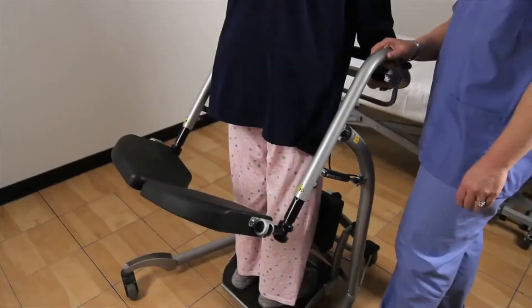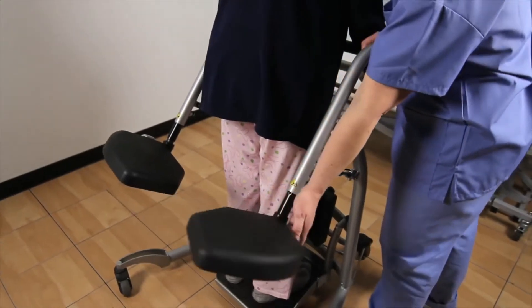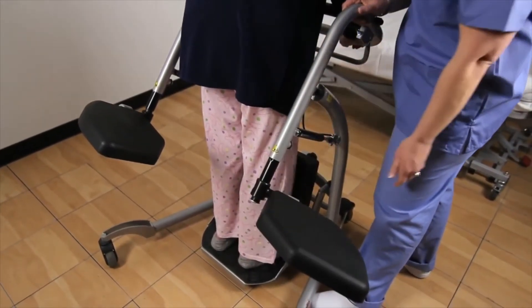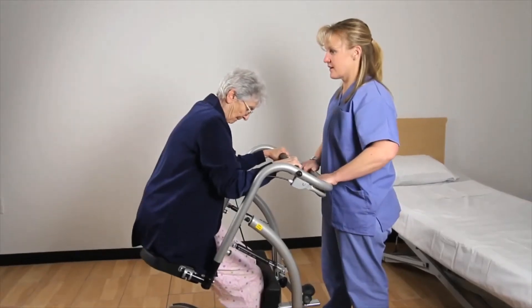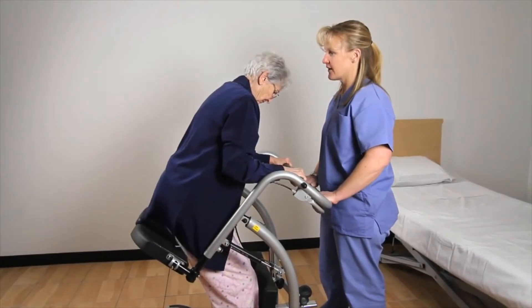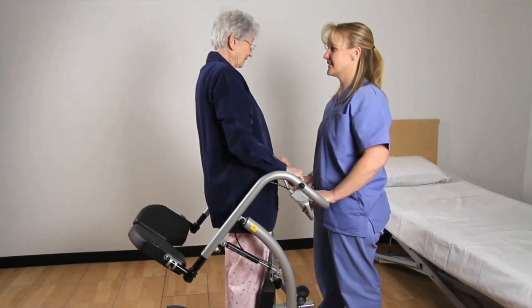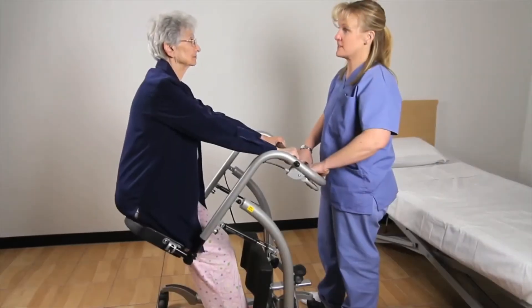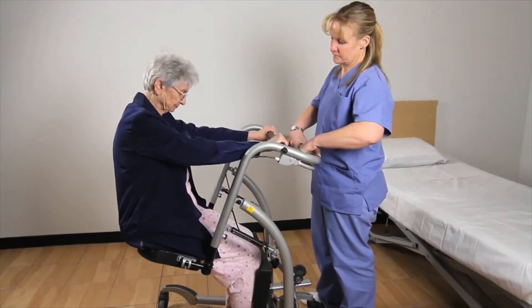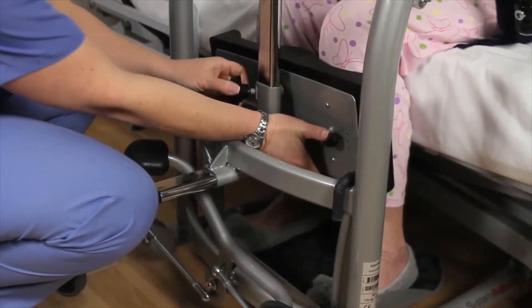When additional space is needed to accommodate the patient, the seat cushions may be turned out to the side by placing two fingers under the seat cushion and lifting up while swinging to the side. The seat can be adjusted up and down by pressing the release handle. To adjust the seat up, ask the patient to stand or lean forward while pressing the release handle. To adjust the seat down, ask the patient to sit back while you press the release handle.